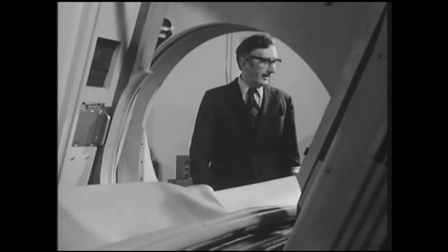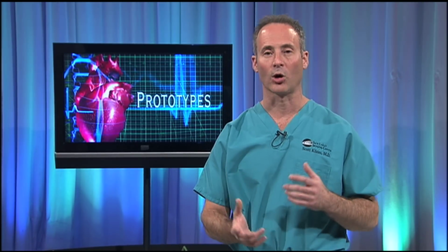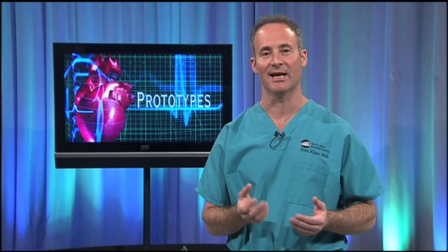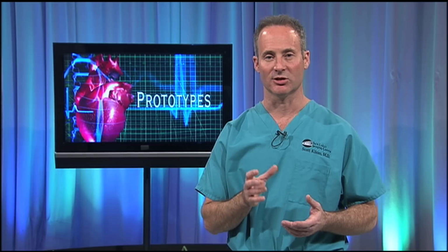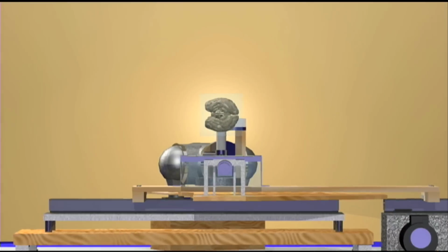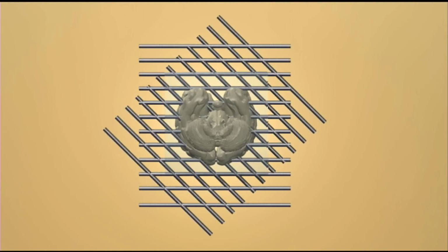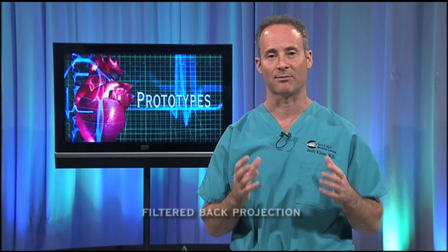At about the same time as the development of the second prototype, the design team working on the development of CT scanning came up with another way to reconstruct these images. As I said previously, the initial reconstruction was the equivalent of solving 28,000 simultaneous equations for a computer programmed in Fortran. It took a long, long time. They developed a system called filtered back projection.